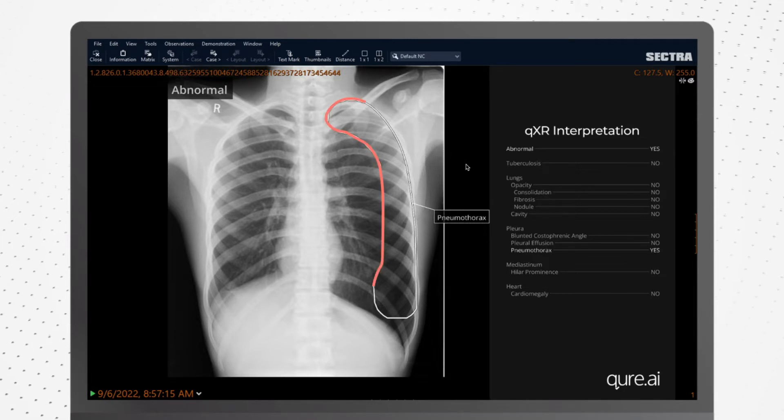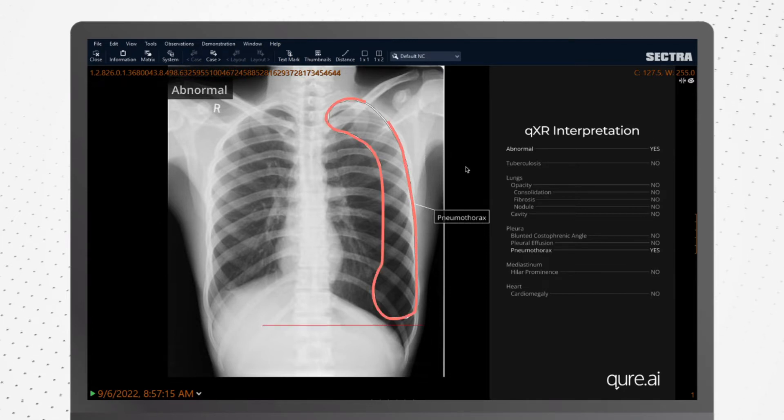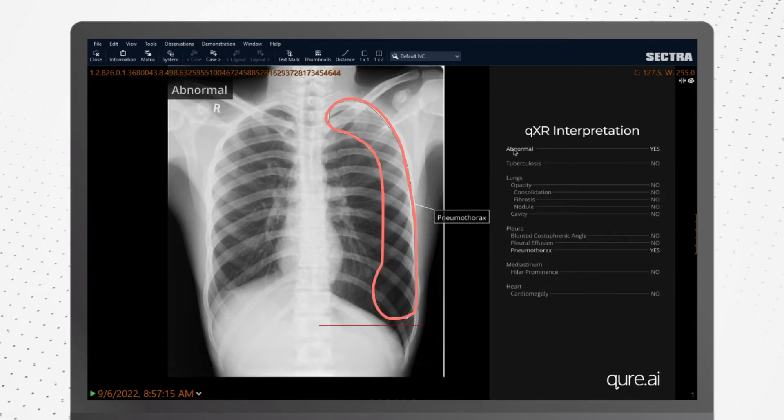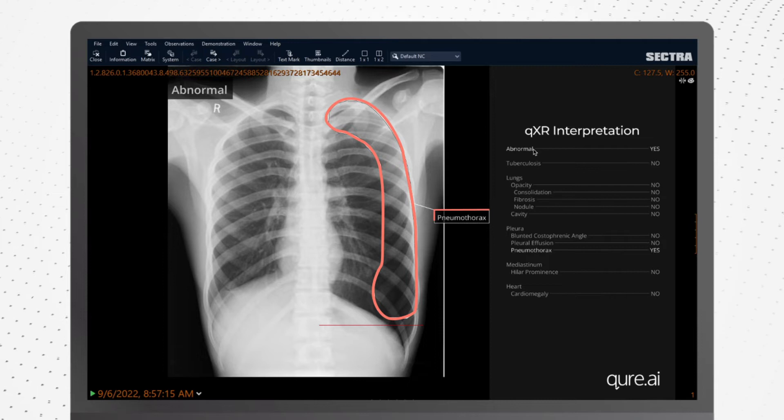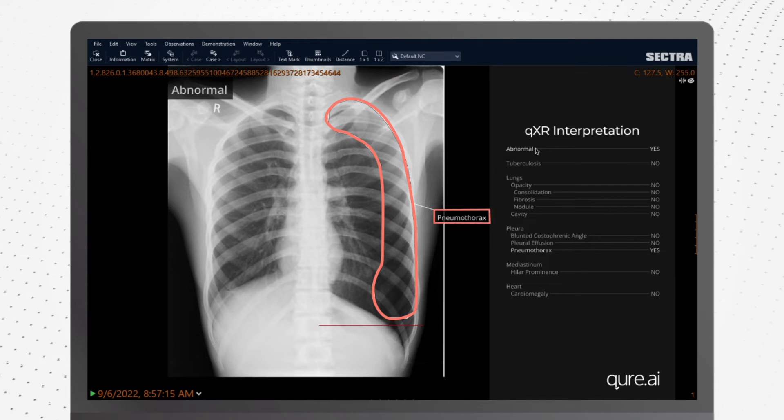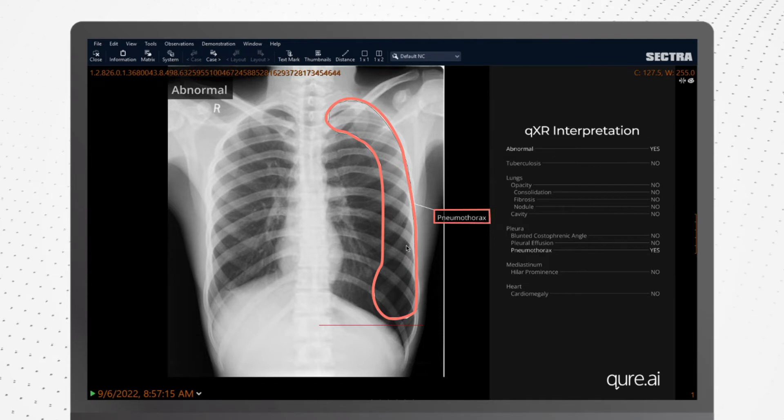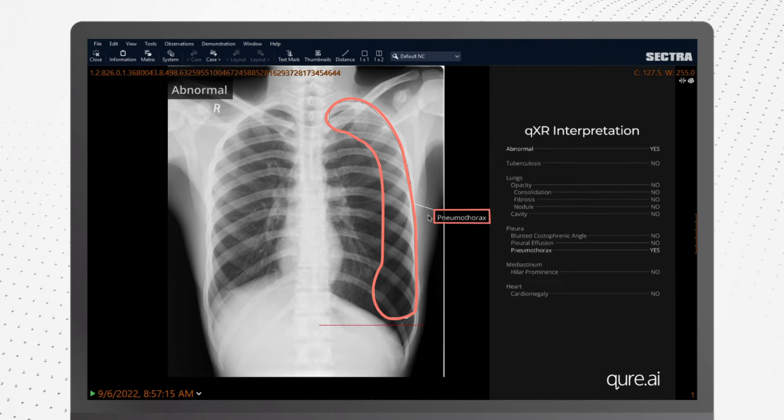The AI overlay indicates any abnormalities and lists the findings, including localizing them on the scan through appropriate contours.